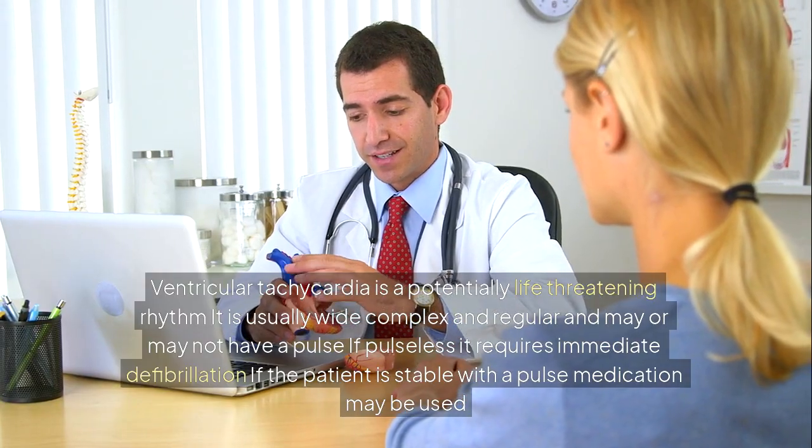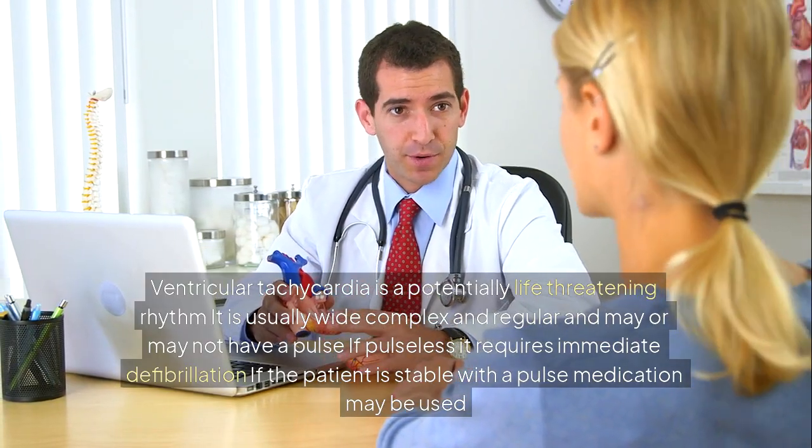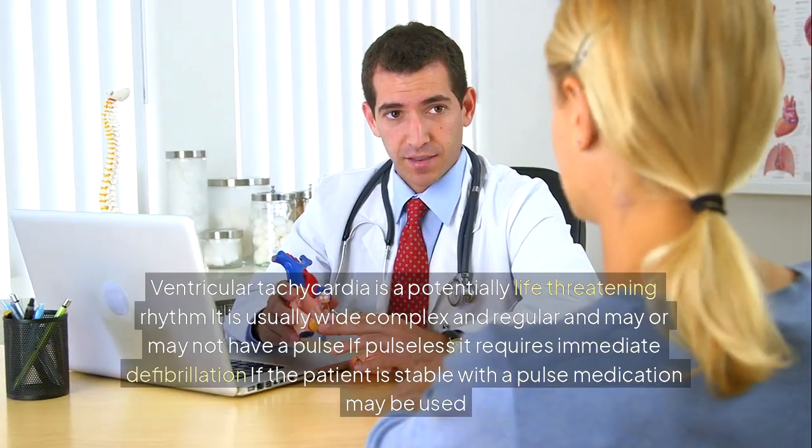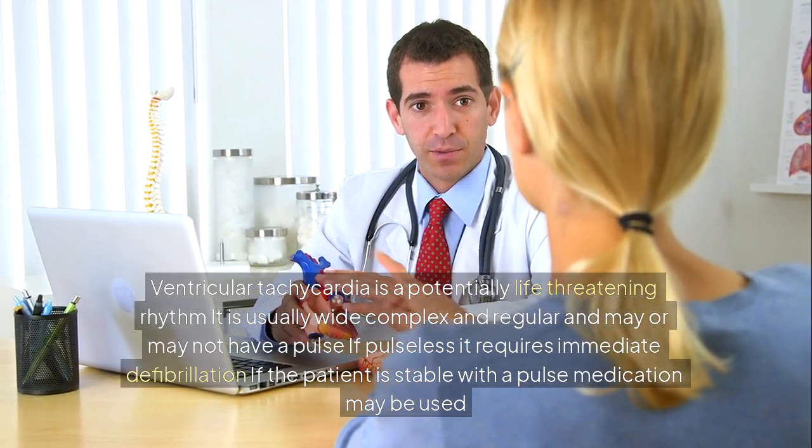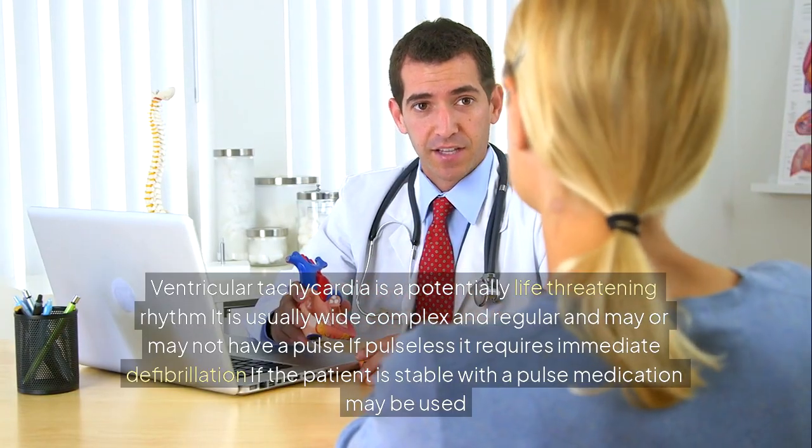Ventricular tachycardia is a potentially life-threatening rhythm. It is usually wide, complex, and regular, and may or may not have a pulse. If pulseless, it requires immediate defibrillation. If the patient is stable with a pulse, medication may be used.